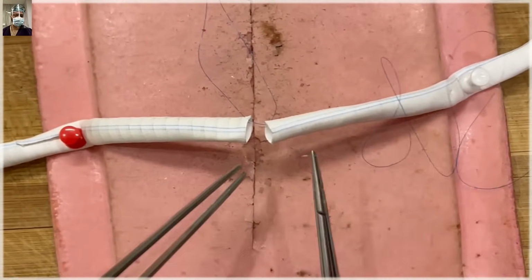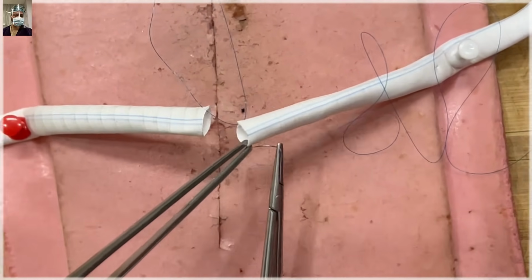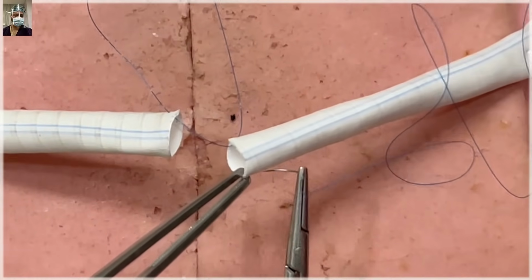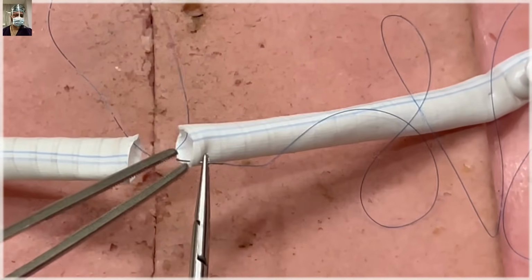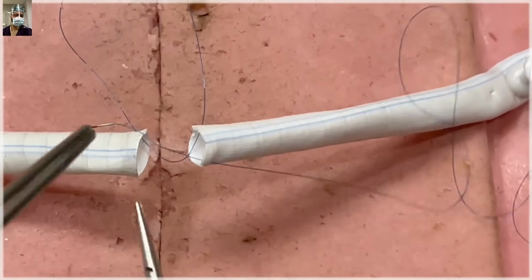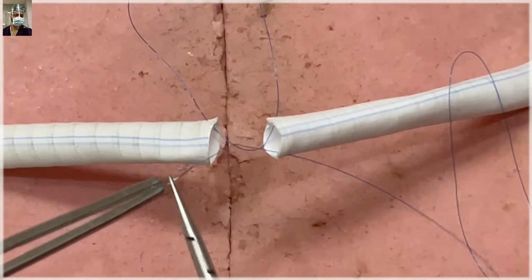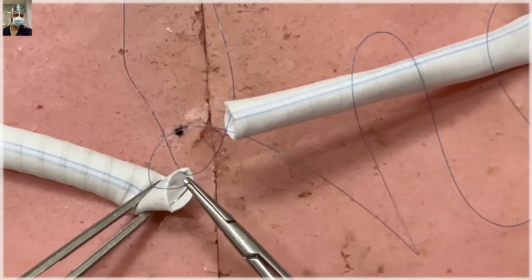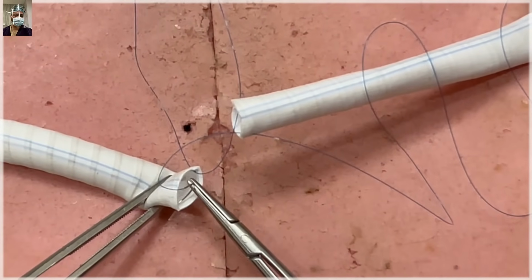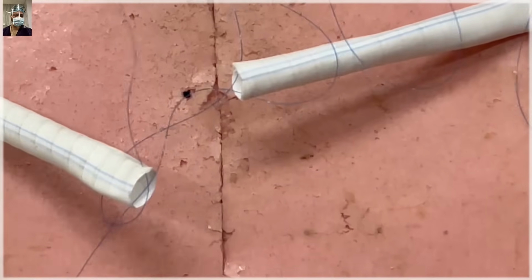The marking of the anterior arterial wall, we have already done. So now I'm taking the 6 o'clock, the end towards the surgeon. Here I'm coming outside in on the proximal or afferent loop, and inside out on the efferent loop. The aim is to keep the knots outside the lumen of the vessel.